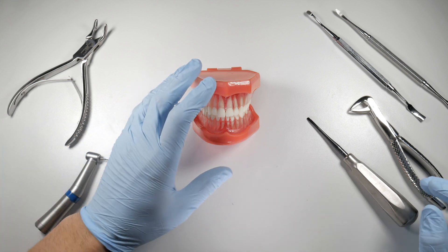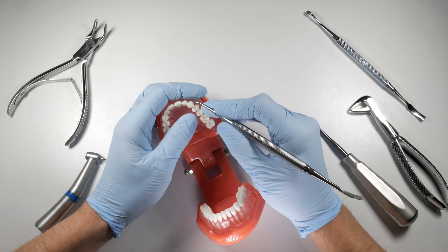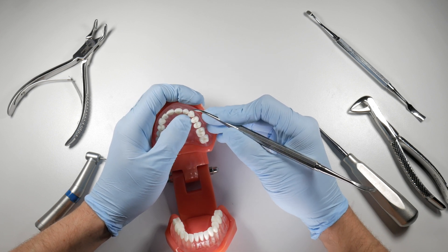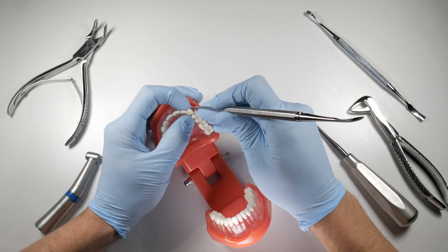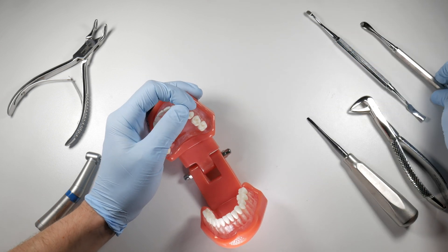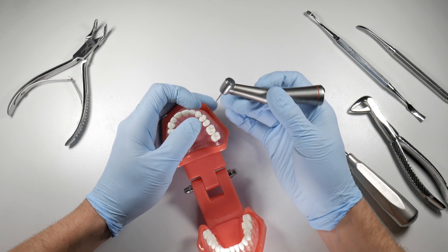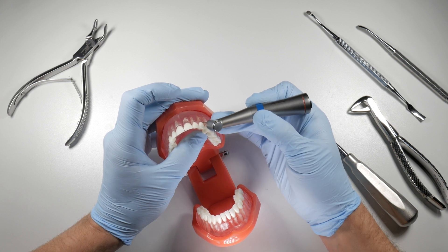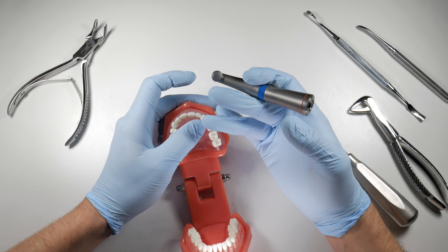If the bone is connected to the tooth but still connected to the periosteum, you can sometimes use a periosteal elevator to help. For example, with an upper canine — a very common tooth to break the buccal plate on — if the tooth is mobile but the bone is moving with it, get your periosteal elevator down along the buccal surface and slowly push and pry to separate the two pieces, keeping the bone attached to the periosteum while delivering the canine. If the bone is thick enough, you can use a thin bur like a 700 or 699 surgical-length bur with your surgical handpiece to remove a sliver of tooth — essentially doing a crown prep at the expense of the tooth to free the bone from it.